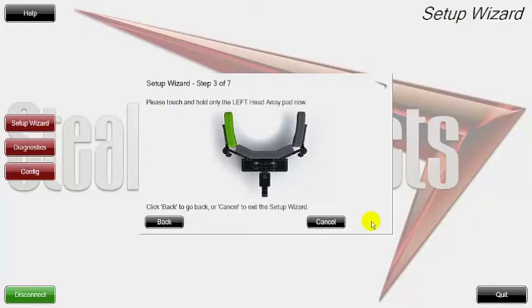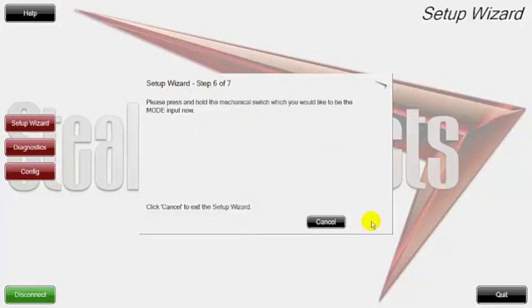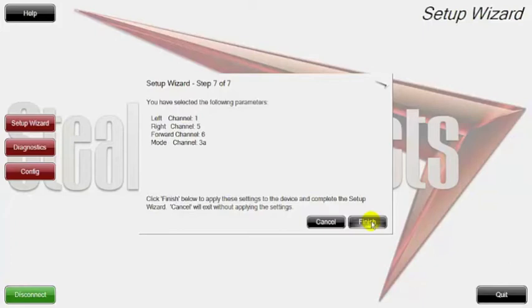The next step is asking me to give it a left command. I'm going to go ahead and give a left command on the head array and hold. Now it's gotten that command. I'm going to give a back pad command and then a right pad command. Now it's asking me for a mode switch. Once I plug this into the port I need, it will let me configure my mode change. It tells me the left command is on channel 1, the right command is on channel 5, the forward command is on channel 6, and the mode is on channel 3A.